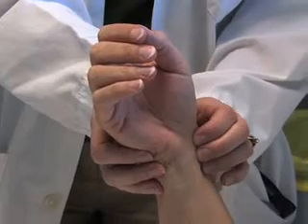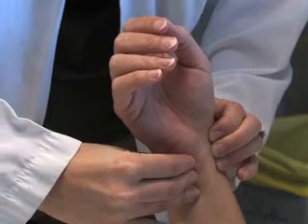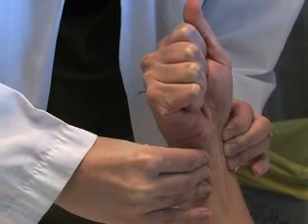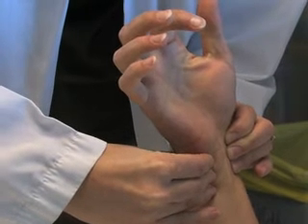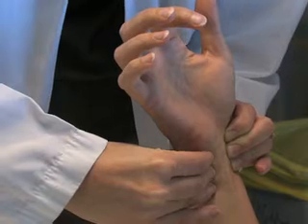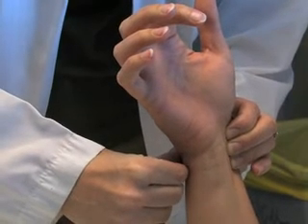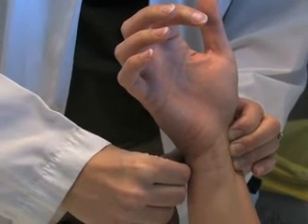To perform the Allen test, occlude both the ulnar and radial arteries. Instruct the patient to make a fist to drain the blood from the hand. This should be done for approximately 30 seconds. Instruct the patient to unclench the fist. The patient's palm should appear blanched or pale. Now release pressure only from the ulnar artery. Adequate collateral circulation is indicated by the return of normal colour within 10 seconds.